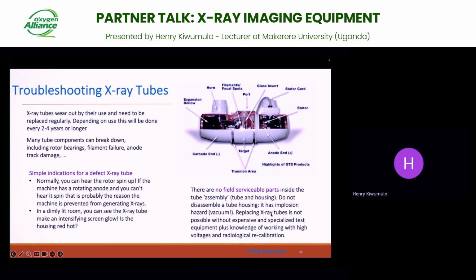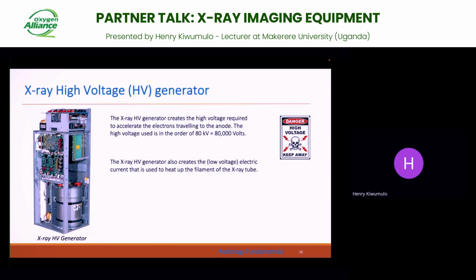So that's why we don't go further to opening. Most of these tubes are taken back to the manufacturing plants to be dealt with because of those intricacies.